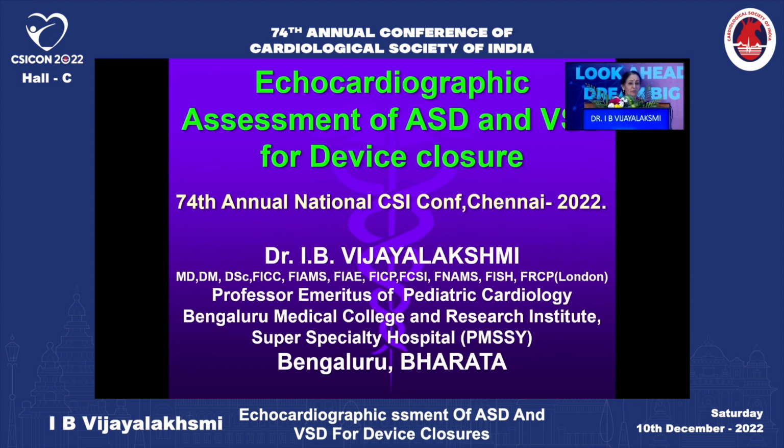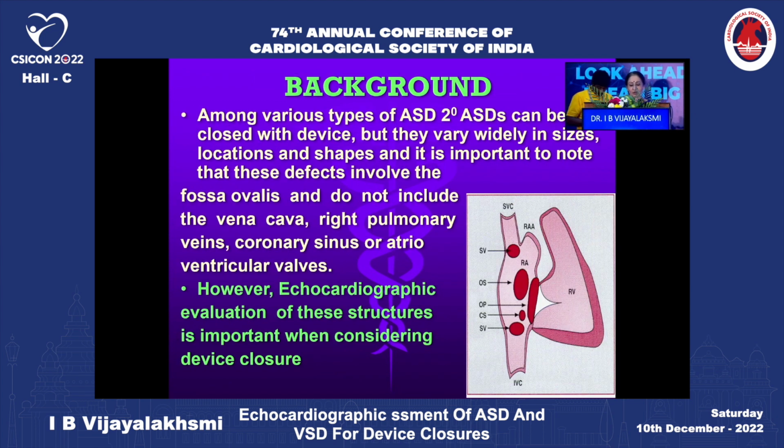So with the advent of MRI and CT, everybody wrote off echocardiography and said that echo will become obsolete. But in fact, echo has come with a bang, because in the cath lab, it is the echo, whether it's TTE, transthoracic, or ICE, that is important.